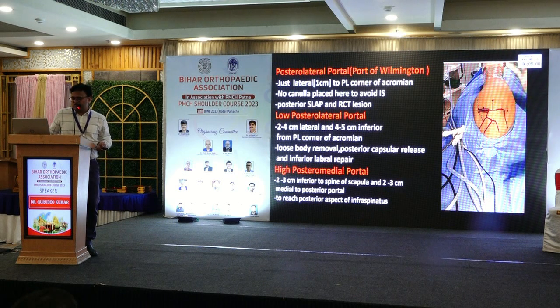Then the high posteromedial portal is located here, 2 to 3 centimeter inferior to the spine of the scapula and 2 to 3 centimeter medial to the posterior portal, and it helps you pass the thread in a retrograde manner through the infraspinatus tendon.